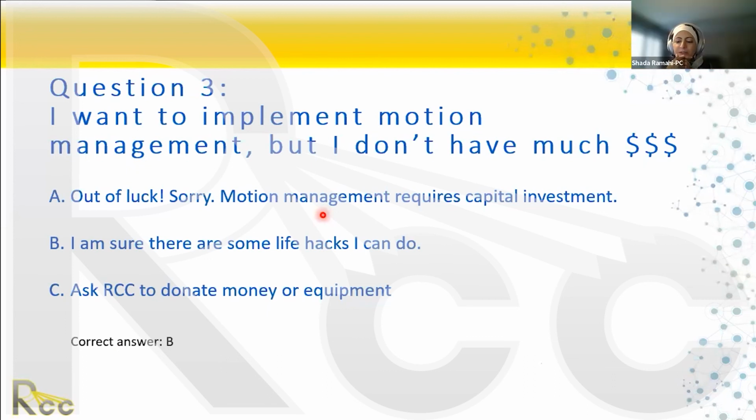So we place the ISO center at the 50% phase, and that's done during the CT sim itself. The doctor indicates on the 50% phase where the tumor is, and then we have the lasers move to locate that location on the patient's skin. However, we don't depend on skin marks for patient setup for SBRT or any other treatment planning or treatment delivery technique.